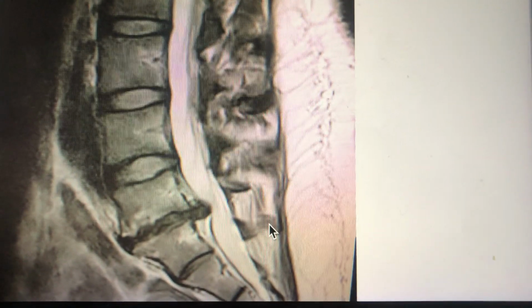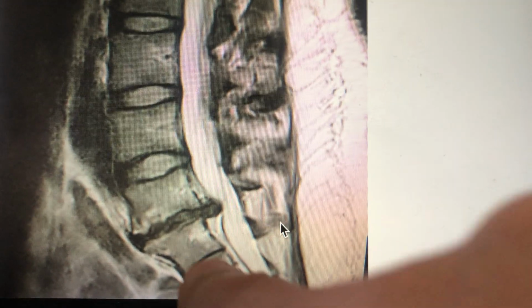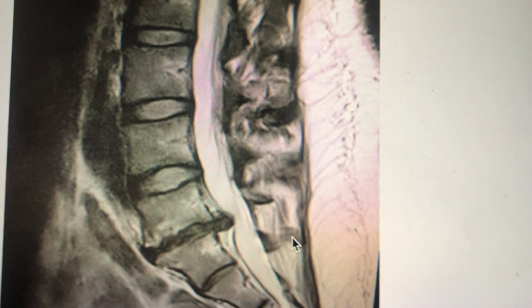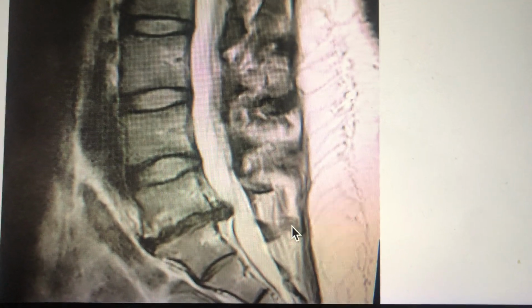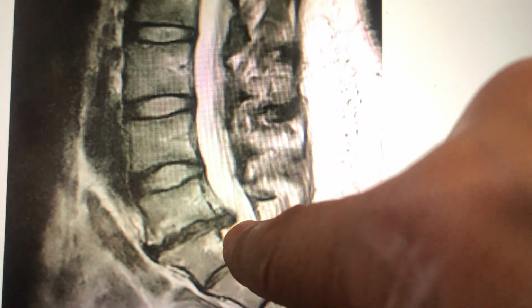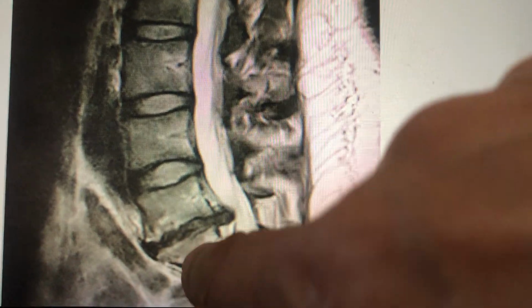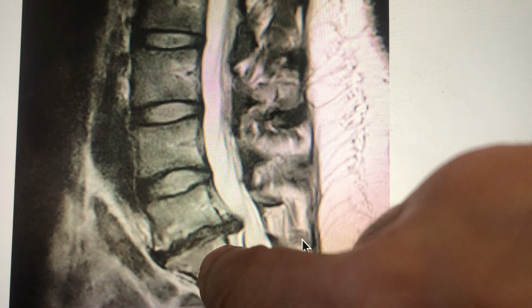Okay, going to go to the next one. This shows a different slice, same disc. You could see it sticking out considerably. There's some white here and there because these bones become edematous or swollen from fluid when the disc is out like that and the bones collapse. That means the circulation across here, which is normal, is impaired, and as a result you get swelling of the bone immediately adjacent to the disc level.